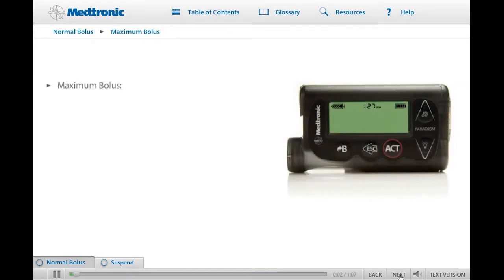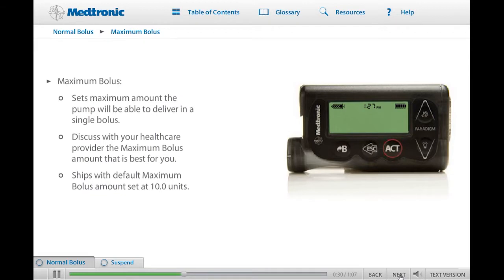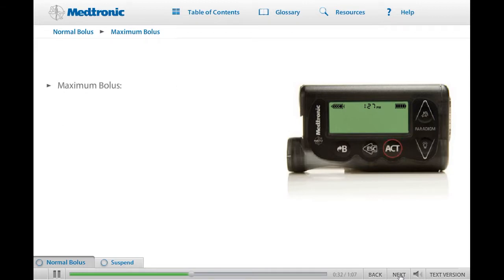The maximum bolus is a safety feature that sets the maximum amount of insulin that can be delivered in a single bolus. It's important to discuss this feature with your health care provider before you decide on the maximum bolus amount that you should set on your pump. The pump ships from the factory with the maximum bolus set at 10.0 units, meaning you cannot deliver more than 10 units of insulin when giving a bolus.